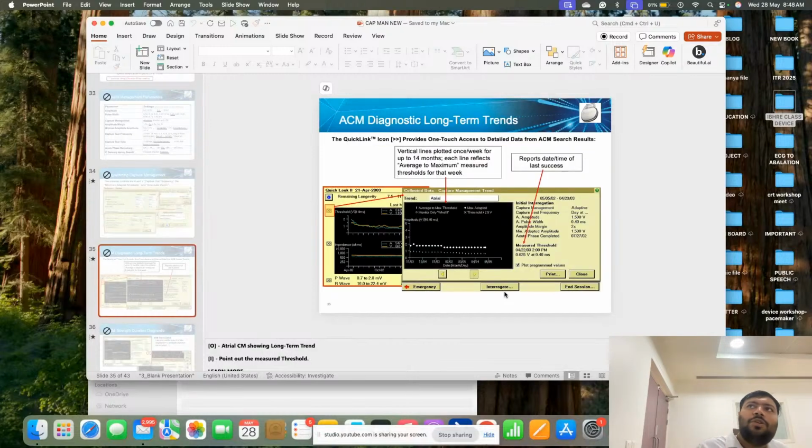So this is all about these things. How sensitive is it, that it is not going to falsely read evoked responses? I haven't seen that happen. What the device will do is go to the next level and say threshold search failure. It will not give the output, and it will increase the output. But I have never seen it falsely find something as a threshold, I mean a regular response. It will go to the next level and say capture management failed, you should do another manual test. I have seen that.